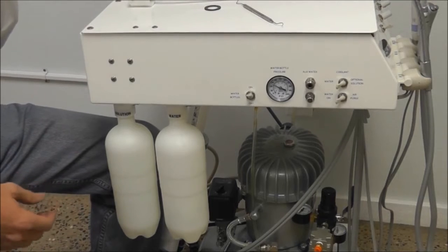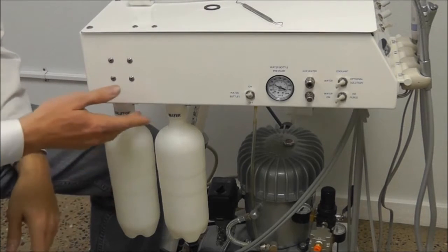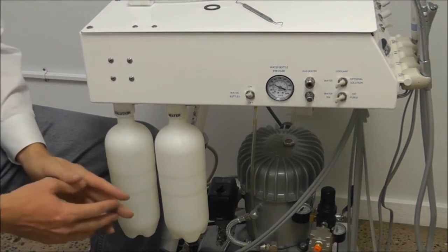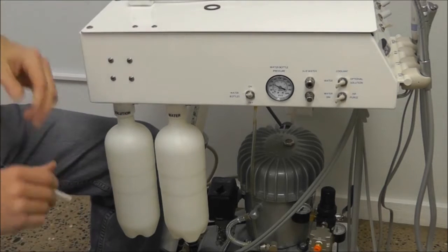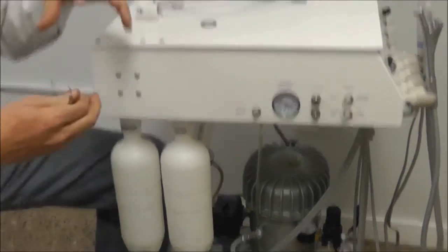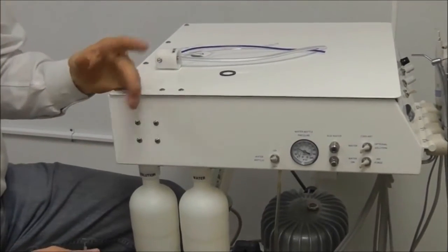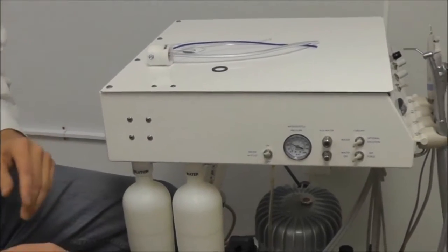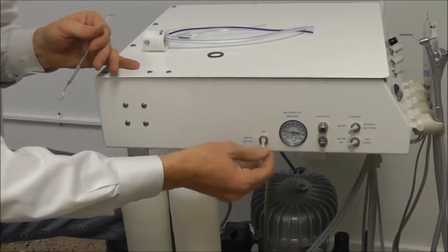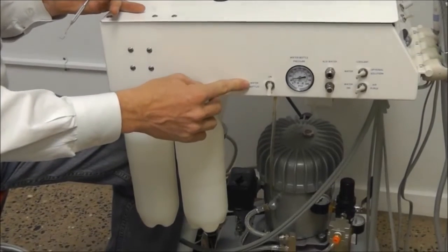Hi, today we're going to replace the gaskets for our solution water bottle connectors. Over time, these gaskets become depressed and worn out, and they have to be changed out periodically. It's nothing big to do at all.